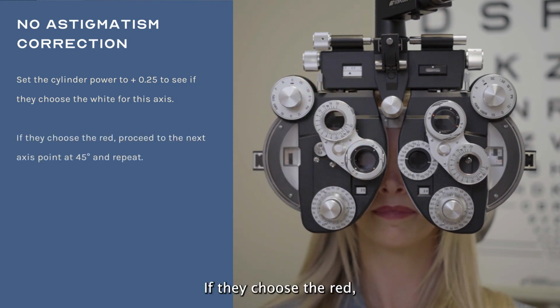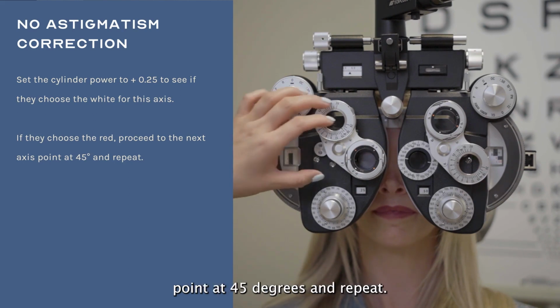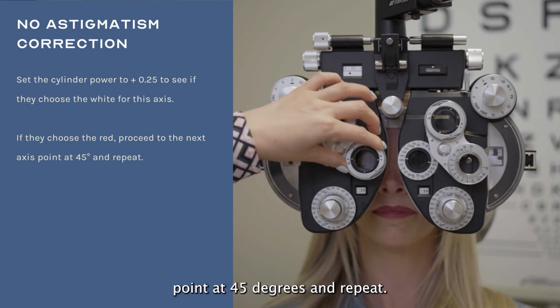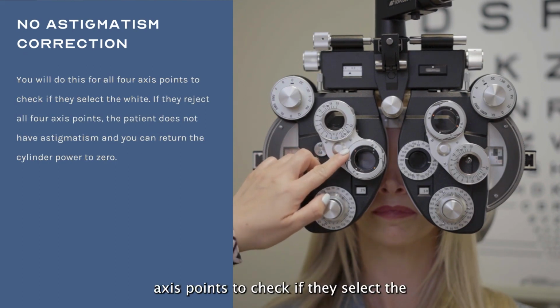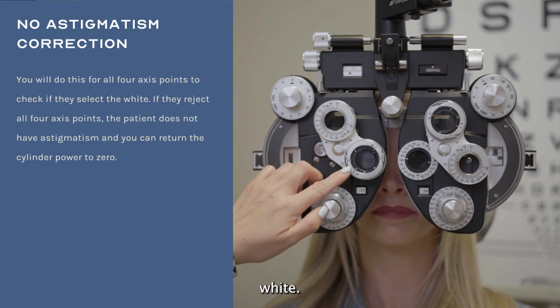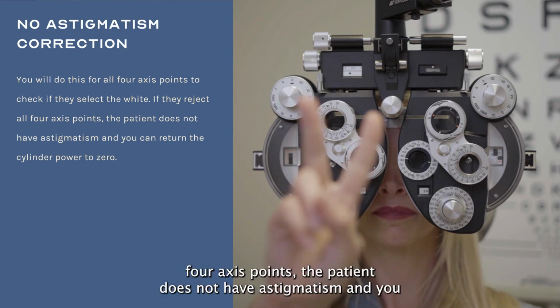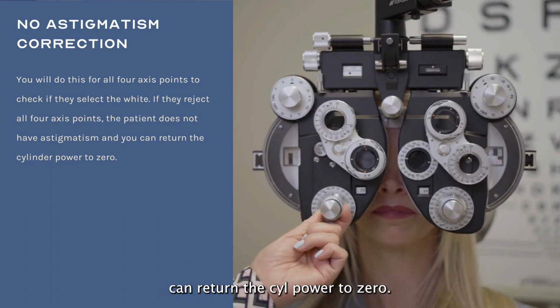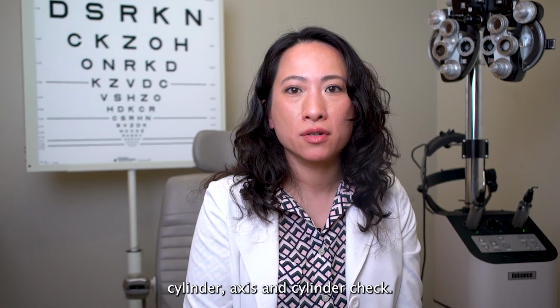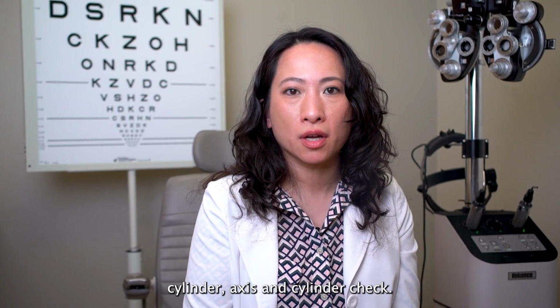If they choose the red, proceed to the next axis point at 45 degrees and repeat. You will do this for all 4 axes points to check if they select the white. If they reject all 4 axes points, the patient does not have astigmatism and you can return the cyl power to 0. You have now completed the initial sphere, cylinder axis, and cylinder check.